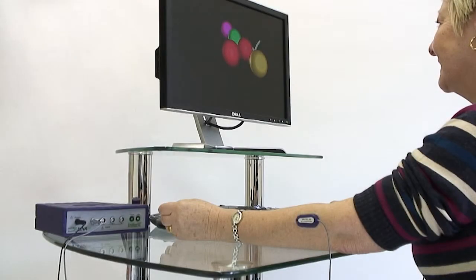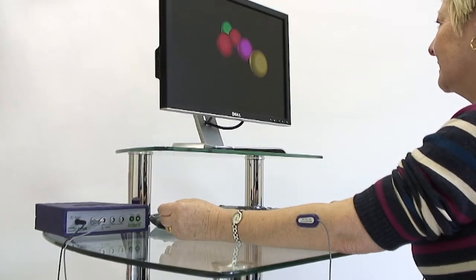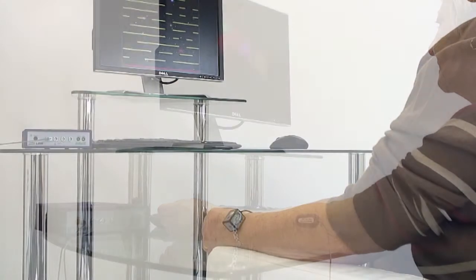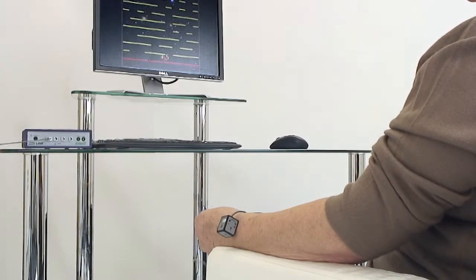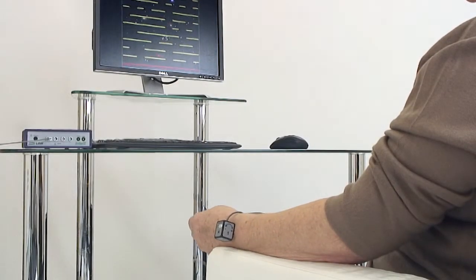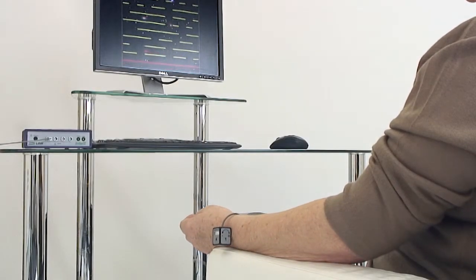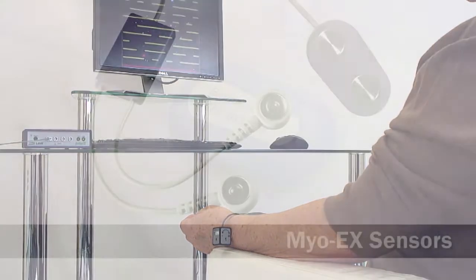The M600 gives immediate biofeedback to the patient and is ideal for undertaking progressive exercise throughout the whole rehabilitation process.